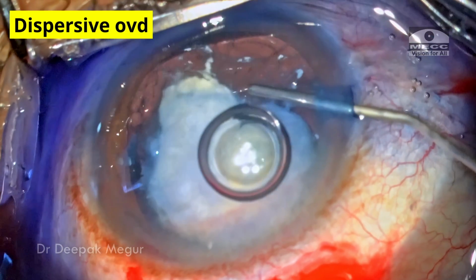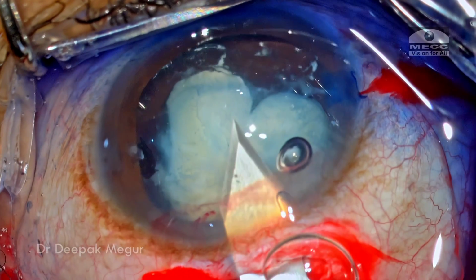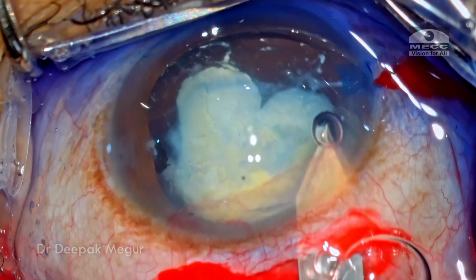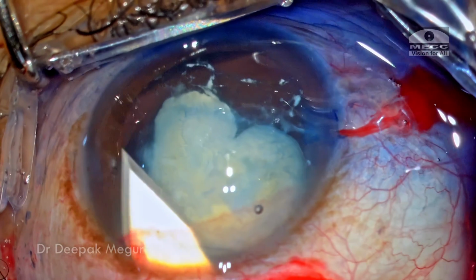Now is the time to inject OVD into the eye. The internal incision has to be created. I'm using a sharp 2.8mm bevel up keratome to make the internal entry. Care is ensured that the inner lip always runs parallel to that of the limbus.